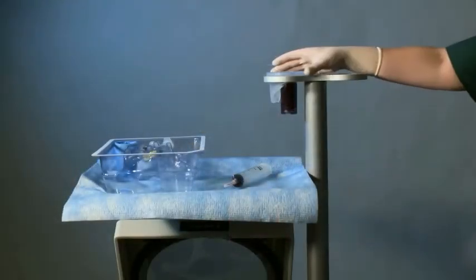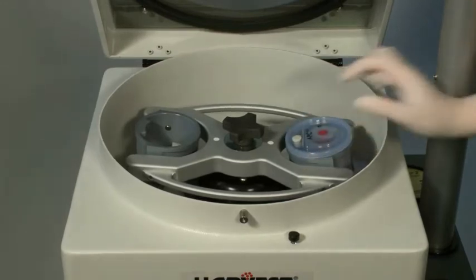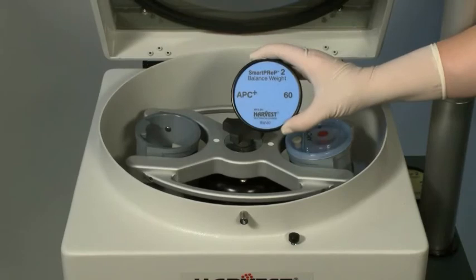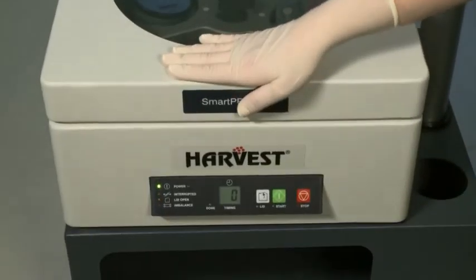Place the filled process disposable into the SmartPrep 2 system in the appropriate orientation. Align the white port on the rotor with the white dot on the disposable. If you are processing one disposable, insert the reusable balance weight with the blue label into the opposing rotor trunnion. Failure to use the balance weight will result in an imbalance and the centrifuge will automatically shut down. Ensure that the process disposable and balance weight are completely seated into the rotor trunnion. Close the lid securely.